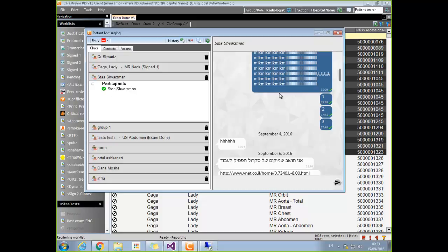So I don't think you can try it here, unfortunately. I played with the drop in instant messaging, it works, but you can use it, and if there are bugs, please report them. You also played with the old one. Plus, you're all in different environments except for the deployment stuff.